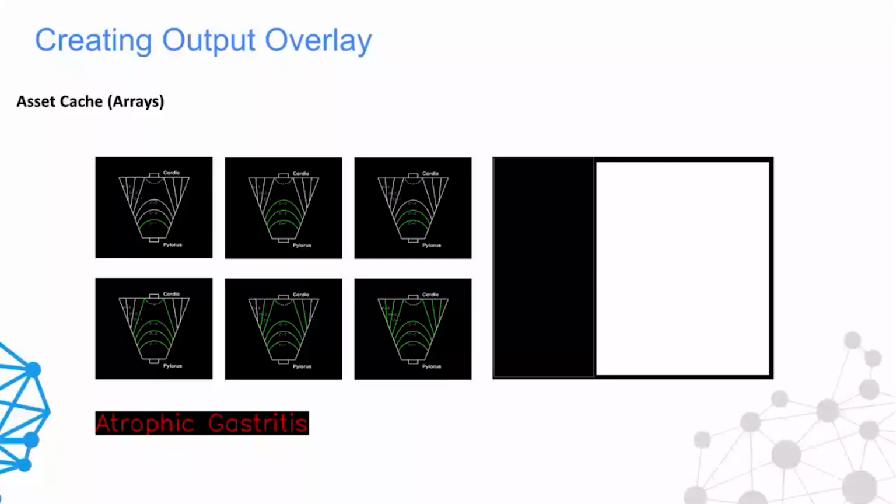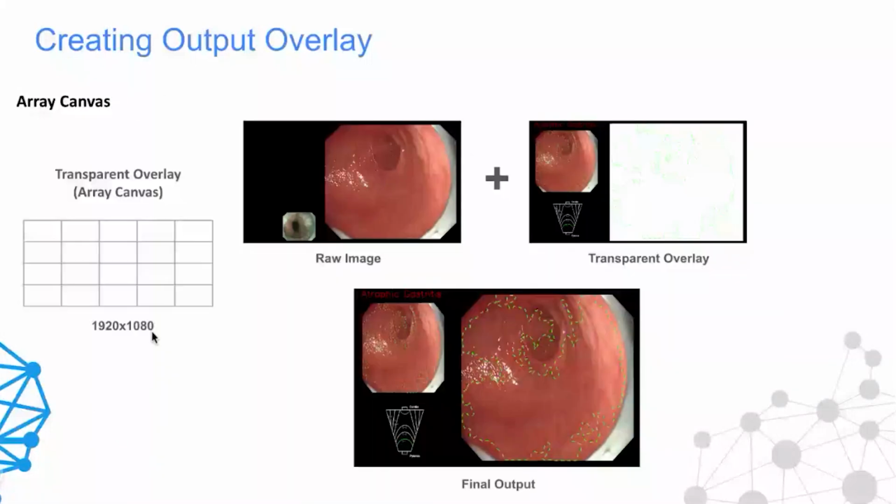So essentially, this is a 1920 by 1080 canvas, which matches the raw image size. Once all the assets and the dynamic content are combined, this is what the final output looks like.